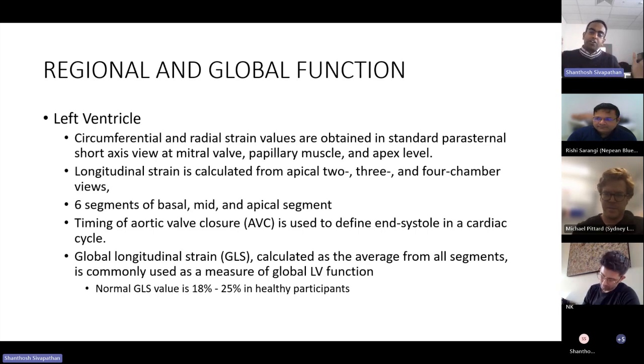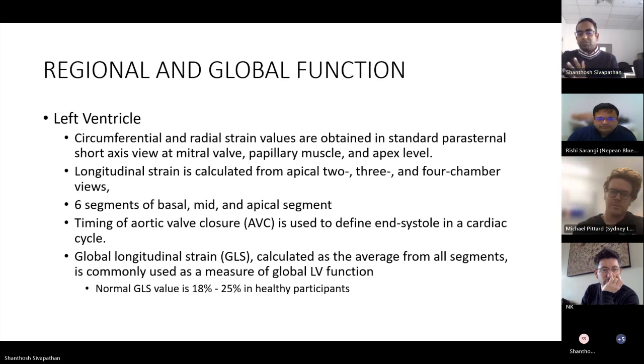We started off with a bigger length and went to a shorter length, so that contraction gives a negative value when we divide it over the initial, longer distance. Does that make sense? People always get confused with minus numbers. Generally anything minus 18 to minus 25 is normal. If you get a strain of minus 10, that is bad.